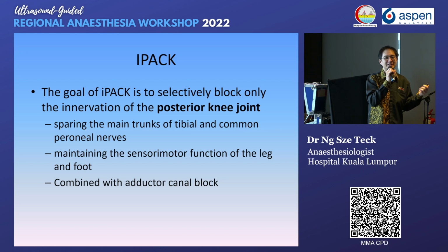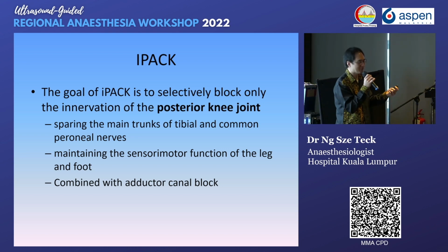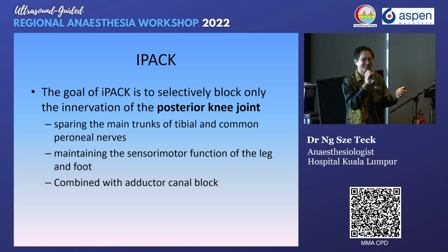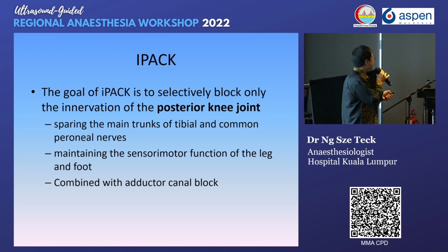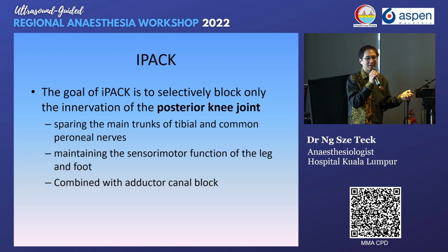The posterior part of the knee is innervated by a branch of the tibial nerve. So whenever you block the femoral nerve, it's also useless because it's by the tibial nerve, which is part of the sciatic nerve. But then some surgeons will not like it if you cause a foot drop in their patient, and their procedure might cause foot drop also. So is it caused by the surgeon or caused by us? That's why this block came out, because they want to provide good analgesia but motor sparing.